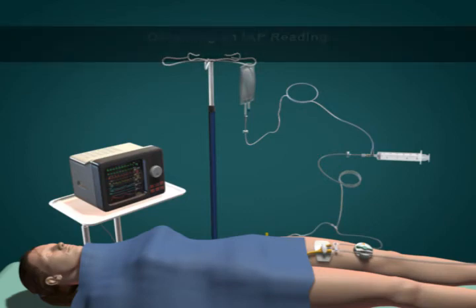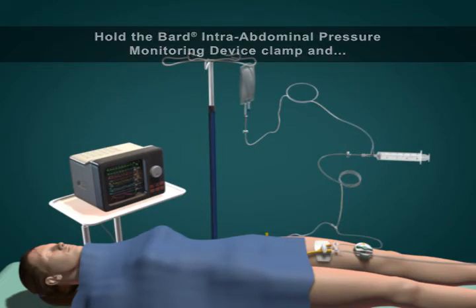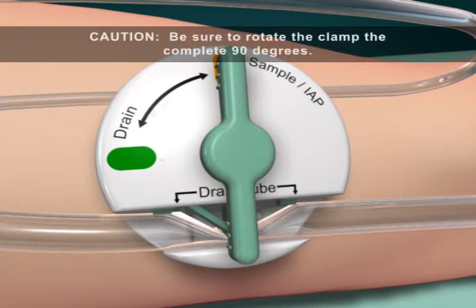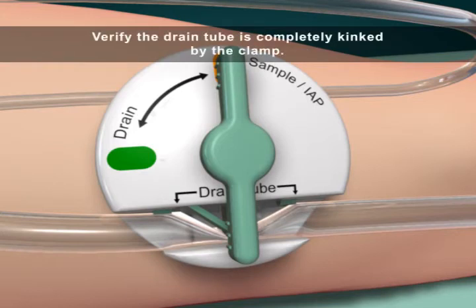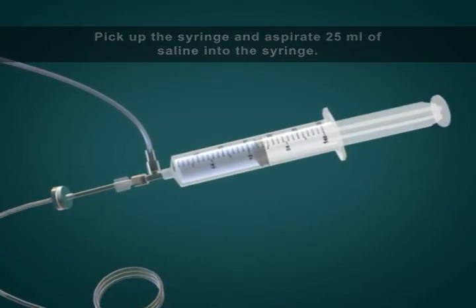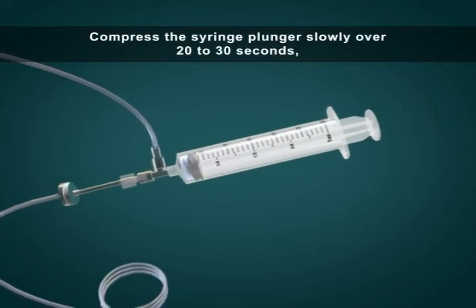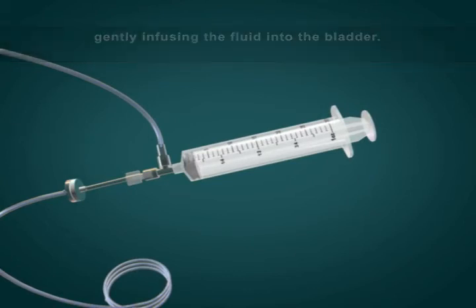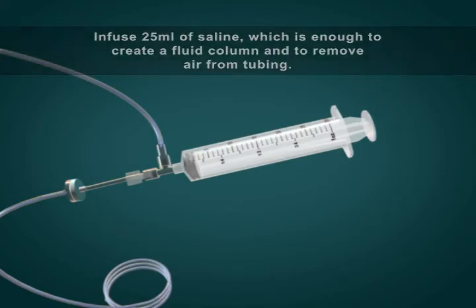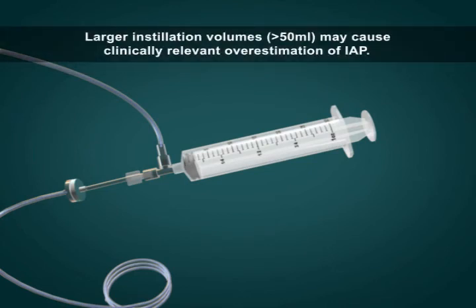Obtaining an IAP reading: the patient must be supine. Hold the Bard intra-abdominal pressure monitoring device clamp and rotate the handle clockwise 90 degrees from the drain position to the IAP position. Caution: be sure to rotate the clamp the complete 90 degrees. Verify the drain tube is completely kinked by the clamp. Pick up the syringe and aspirate 25 milliliters of saline. Compress the syringe plunger slowly over 20 to 30 seconds, gently infusing the fluid into the bladder. Infuse 25 milliliters of saline to create a fluid column and remove air from tubing. Larger instillation volumes greater than 50 milliliters may cause clinically relevant overestimation of IAP.